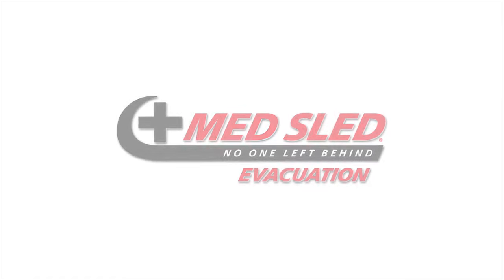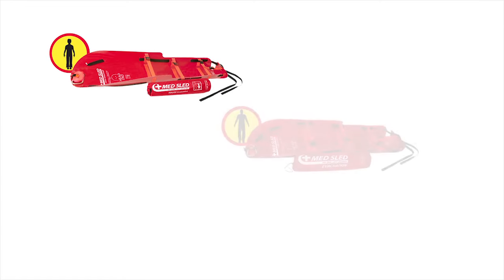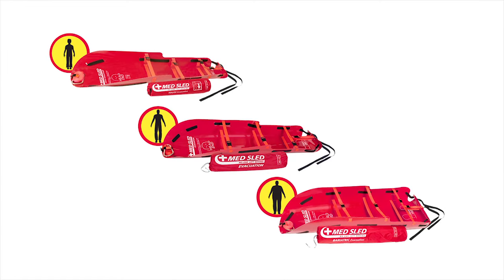It is important to understand that our evacuation sleds are available in three sizes. We offer a youth sled, a standard sled, and a bariatric sled. Prior to reviewing the differences of our three sleds, let's take a moment to review the standard features of our evacuation sleds.